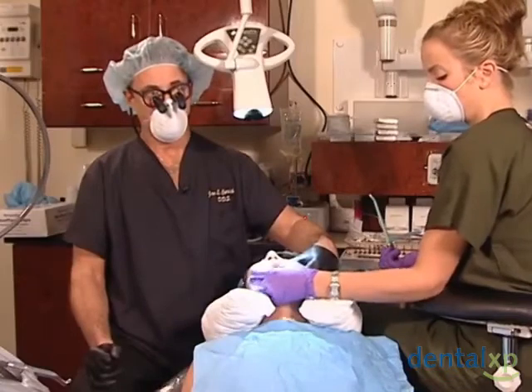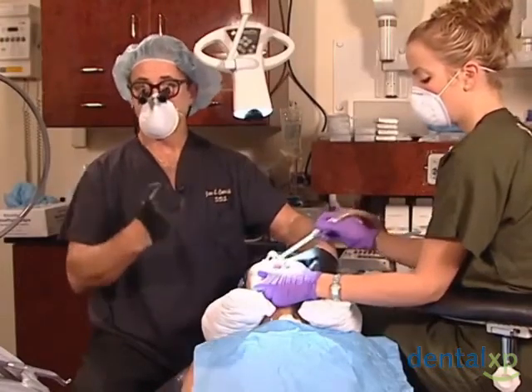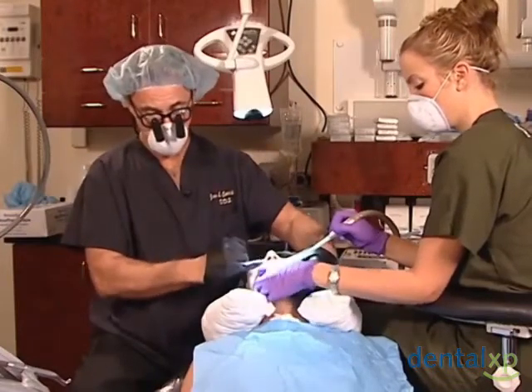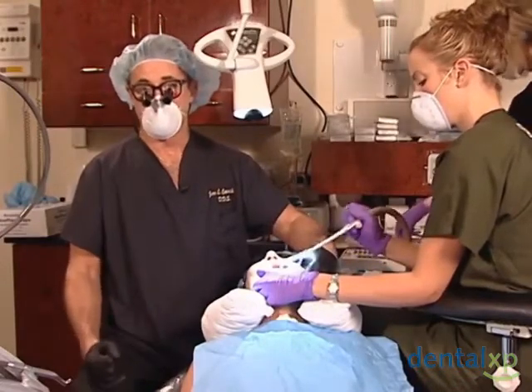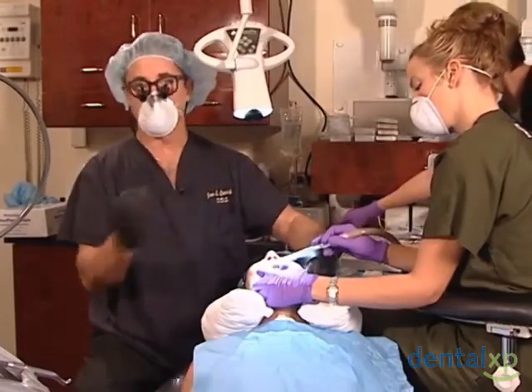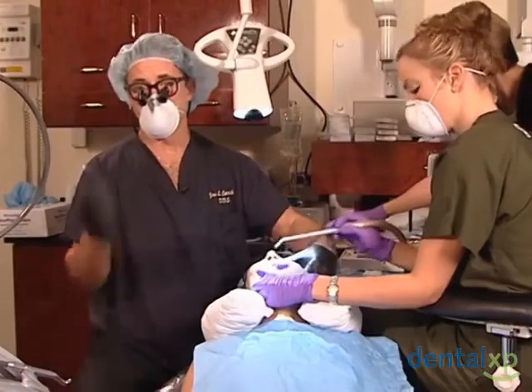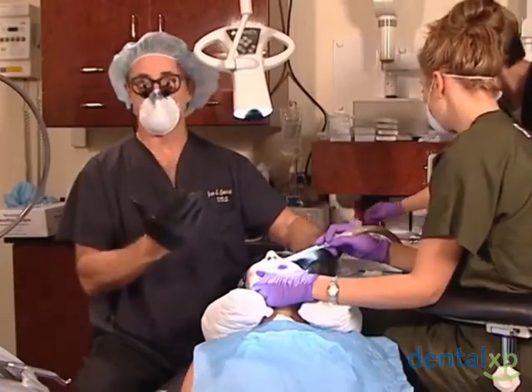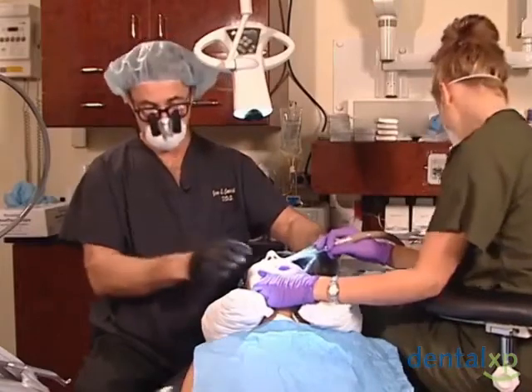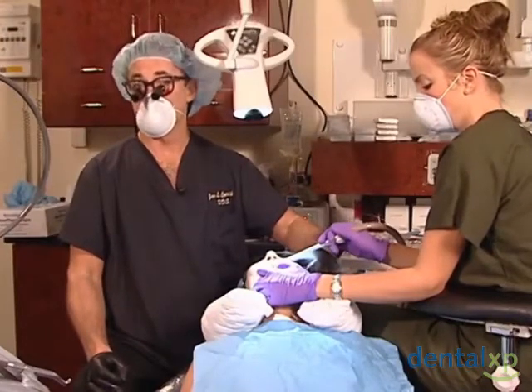It's a trial with the first one you place. I have an indication of what I need to do from experience, but I want to take you through it as if this is my first case — the trial and error to establish that the osteotomy is appropriate for the implant. The key is to use each burr until you don't need it anymore and then move on, rather than going back and forth. Don't be afraid to go in and place your first osteotomy and take an x-ray if you're concerned about where you are.